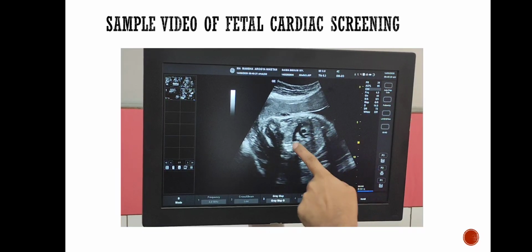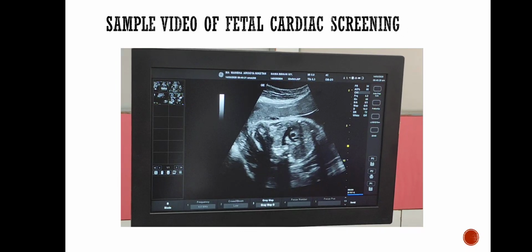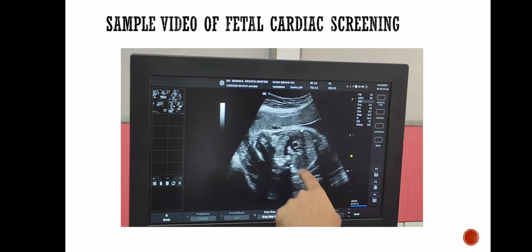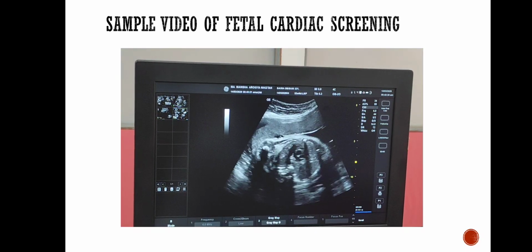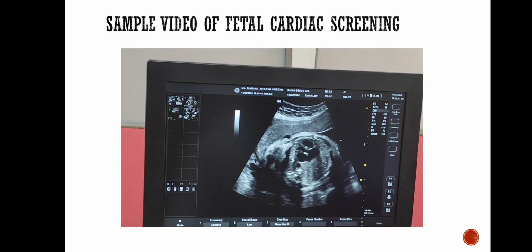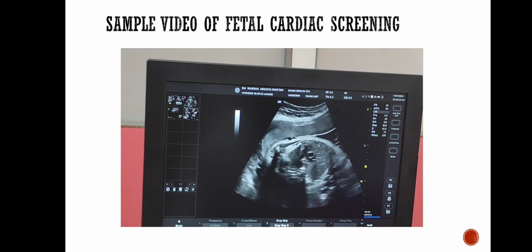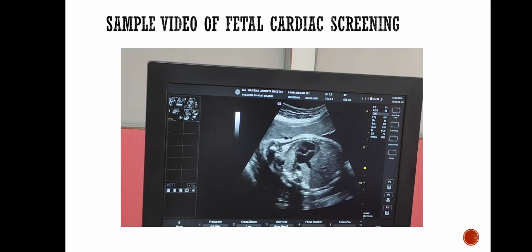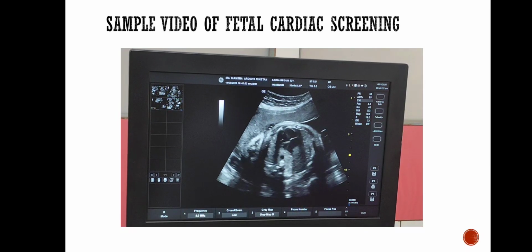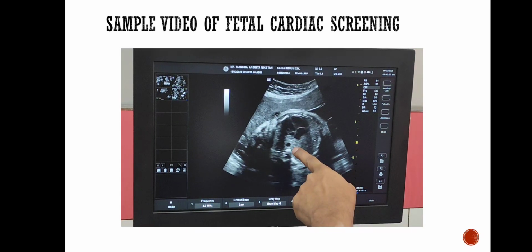RVOT, branching vessels. LVOT, and now fourth chamber view. Descending aorta.